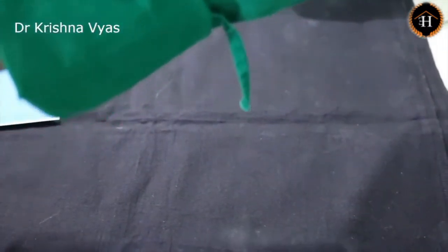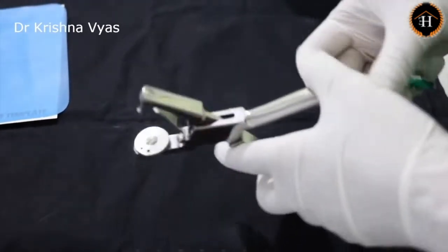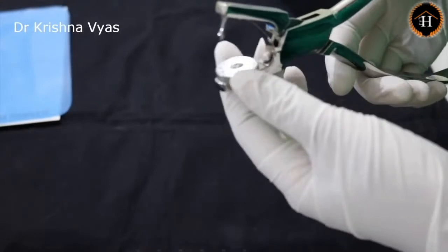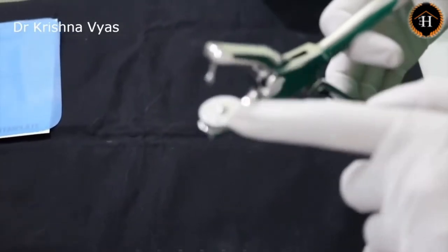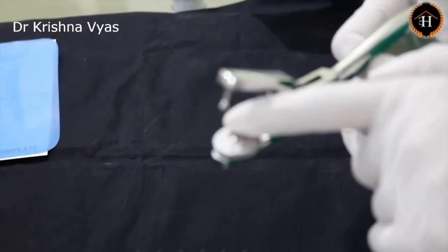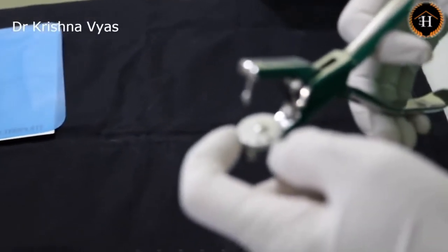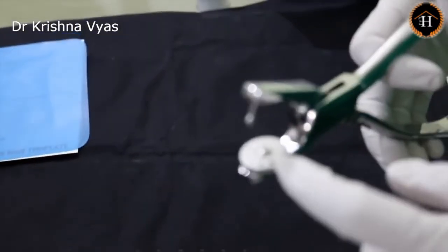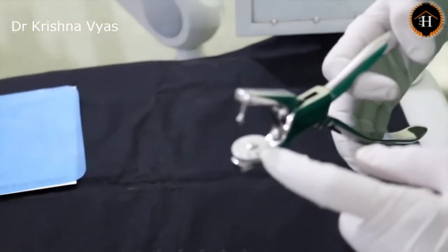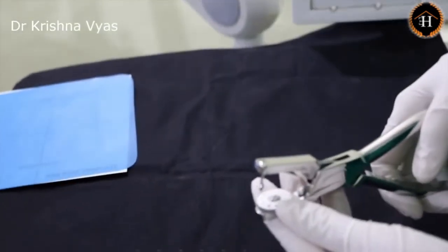Now coming to the rubber dam punch, which is used to make holes wherever the dot has been marked. This is available with either 5 or 6 holes of different sizes. The smallest one can be used for the mandibular central and lateral incisors. The second one can be used for the maxillary central and lateral incisors. The third one can be for the canine and premolars. The last one can be for the first and second molars. Depending on the size of the tooth, we choose accordingly — since I am going for the premolar, I will use the third one.